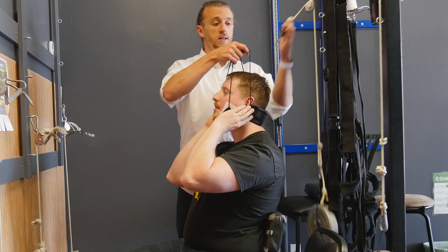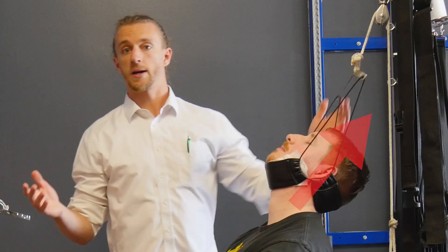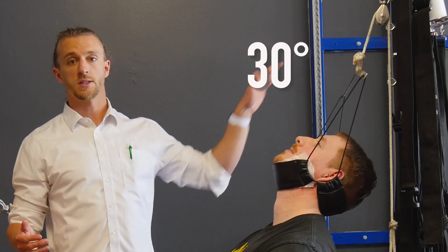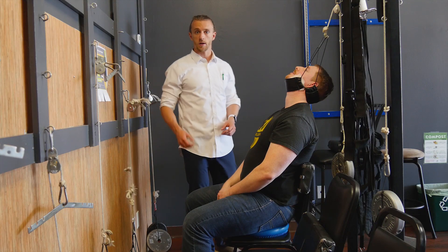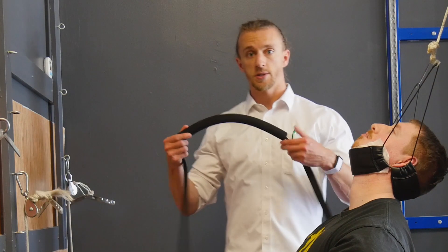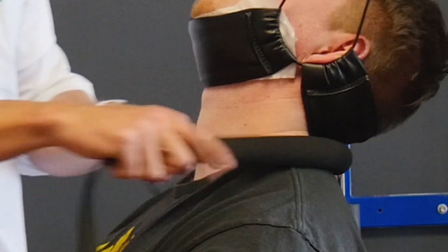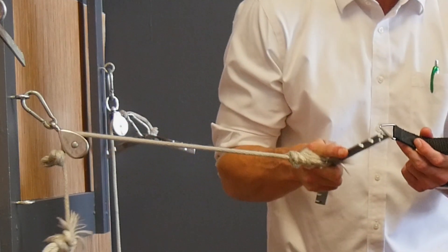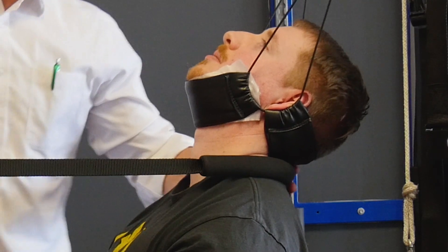We take about 8 to 10 pounds and pull straight back and just let him relax. He's in a relaxed position, pulling up at about 30 degrees — the ideal angle to bring the curve forward. Now we use these straps, get them right in the middle, kind of down towards the base of his neck, and pull some weight forward to bring curve into the neck. I'm going to bring some weight, strap it on, make sure it's all supported, and then let it go.